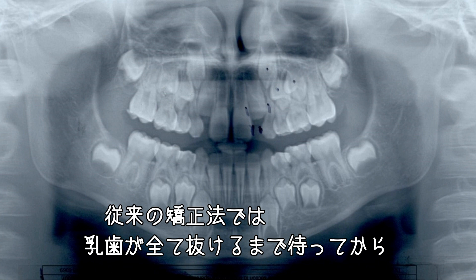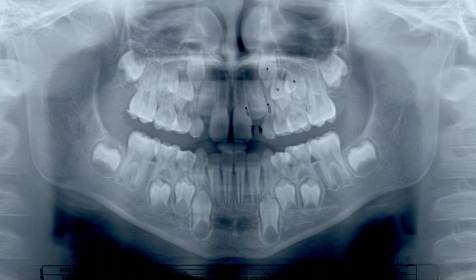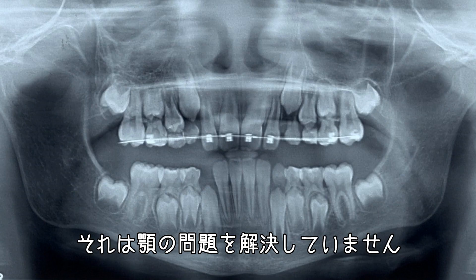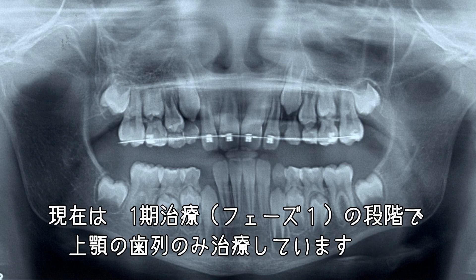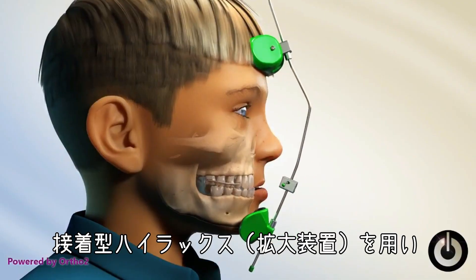In the old days of orthodontics, you'd wait until all those baby teeth fell out and then probably have to extract four teeth to make room, which wouldn't really fix the jaw problem. What we now do — if you look at the phase one treatment — we limited our treatment to the upper arch, using something called a bonded hyrax and a reversible face mask.